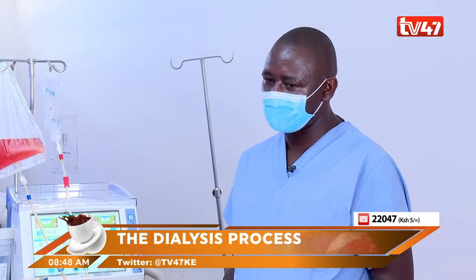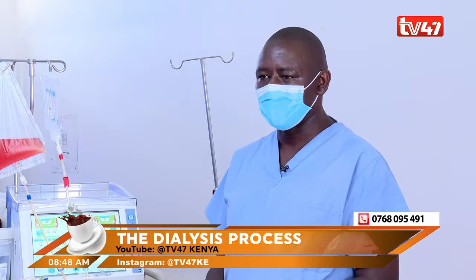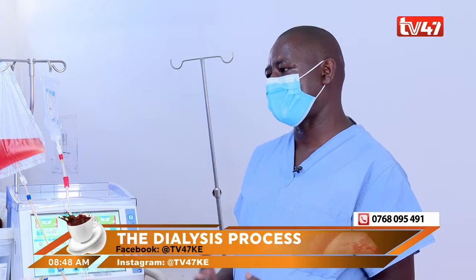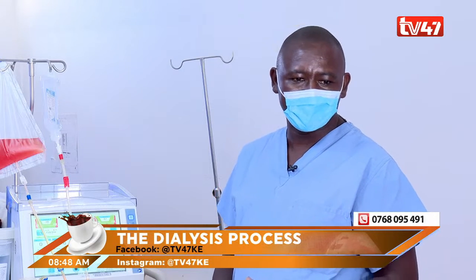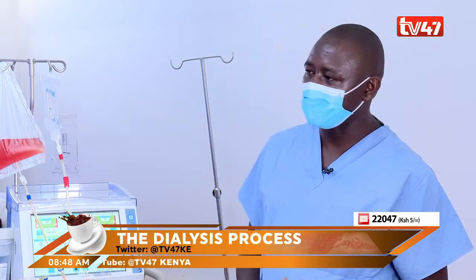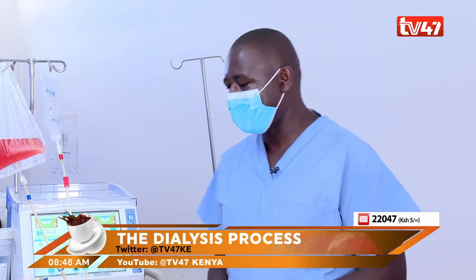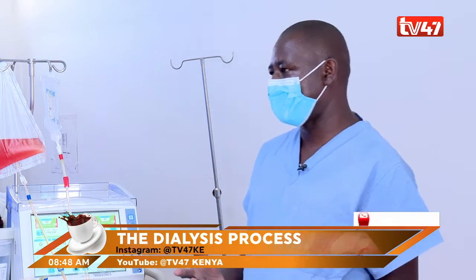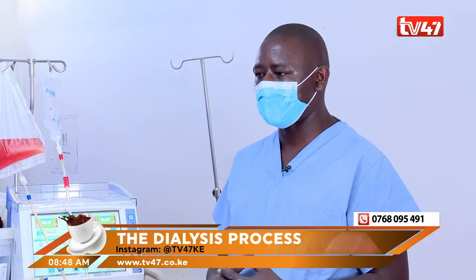In the first experience, usually we have a counselor who explains the procedure to the patient. So when the patient is coming here, he knows what's supposed to be done. Most of the patients, when they enter here, come and take their weight. We settle them in bed. We do their blood pressures and see how their pressures are doing. We do blood sugar if they are diabetic patients.